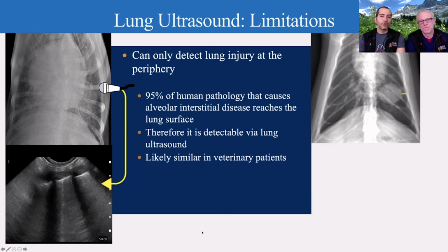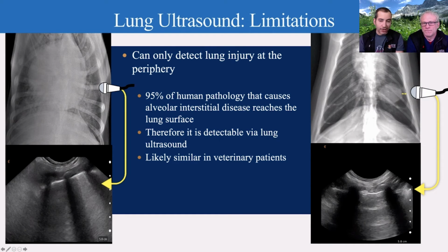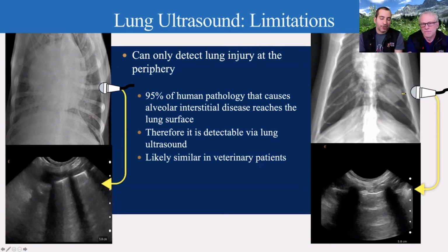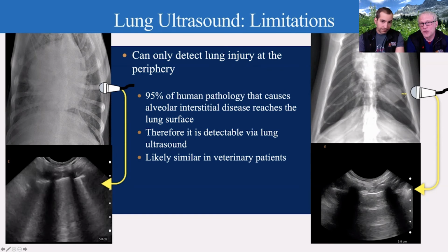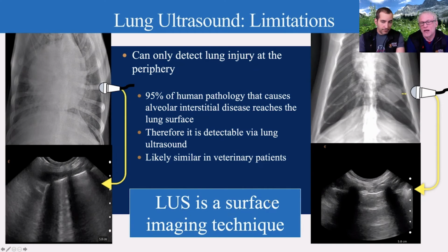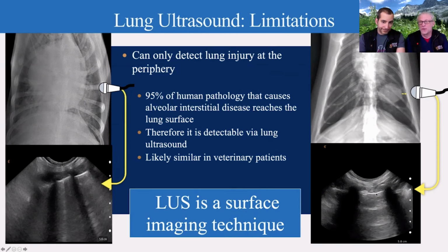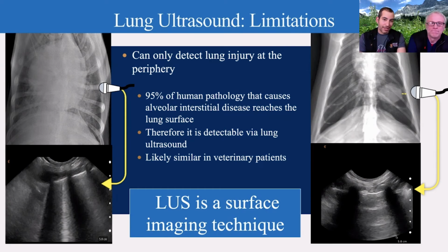But it's important to note that there are some things you may miss if they don't reach the lung surface, like this nodule here. Then you're going to have air between that nodule and the ultrasound probe, in between the pleura. You're not going to see that, Dr. Boysen. All you're going to see is just a normal glide sign. Yeah, so if I look up here, I've got a little yellow arrow separating that tissue abnormality from the lung surface, because it really is a lung surface imaging technique, Dr. Chalhoub. So if it doesn't reach the surface and there's air separating it, all I'm going to see is a soft tissue air interface. Even with the lung sliding, I might miss the pathology in this lung that's moving back and forth, but still separated from the lung surface. Right, because air is an enemy there, Dr. Boysen. You bet.